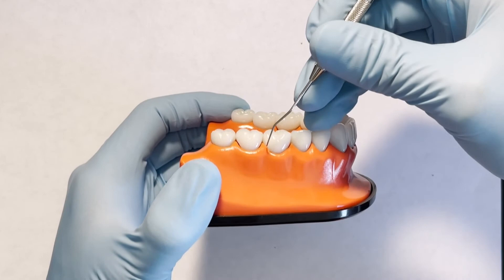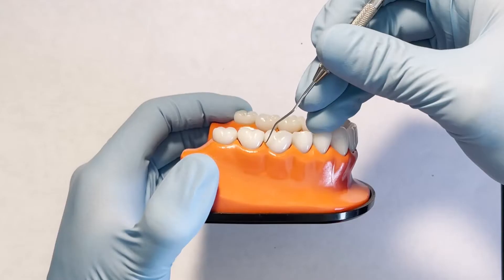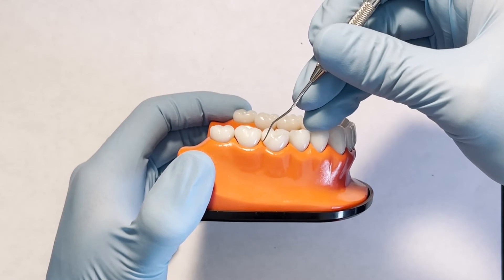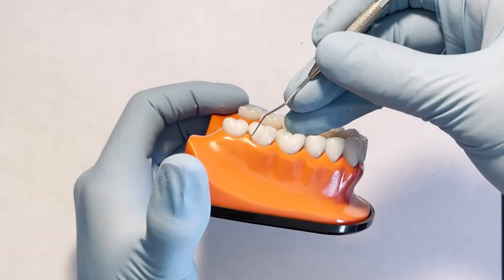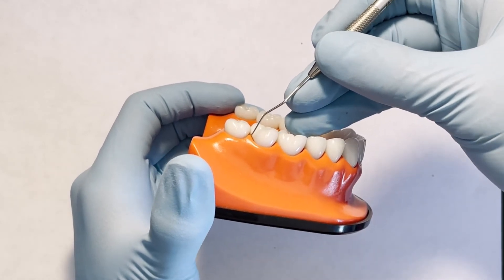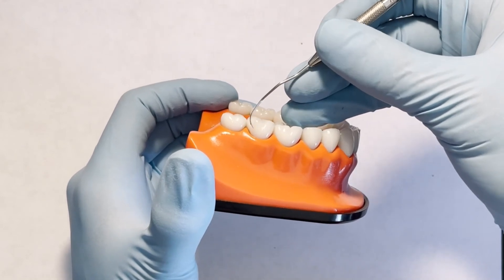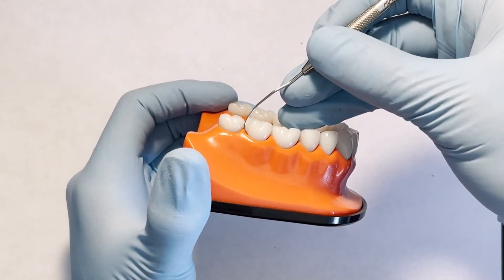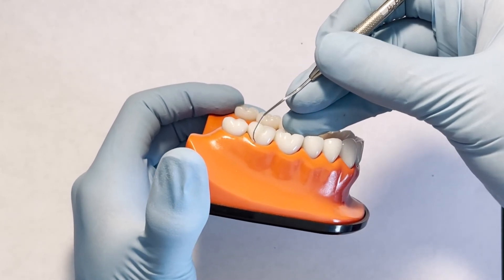After positioning yourself and determining the correct working end, you're ready to begin exploring. Begin by placing the last third of the tip against the tooth supragingively — make sure you're not using the very tip to explore, just the last third. Gently slide the tip below the gingival margin and make short overlapping strokes, making sure to roll the instrument to keep the tip adapted at all times. Use light wrist-activated strokes to progress around the tooth surface.